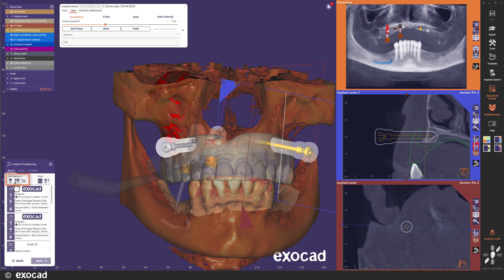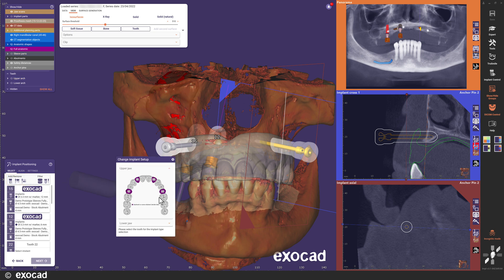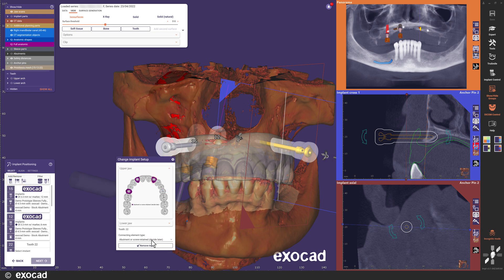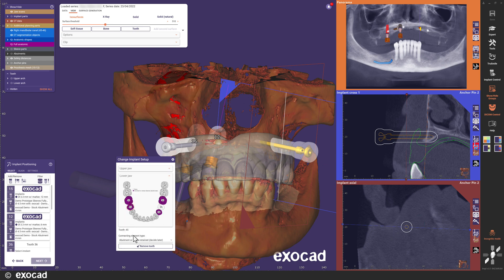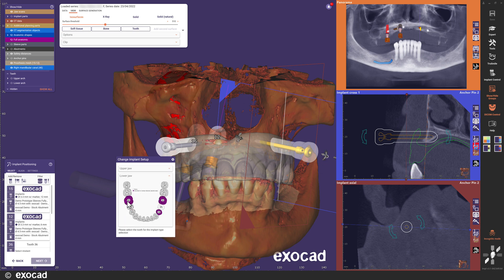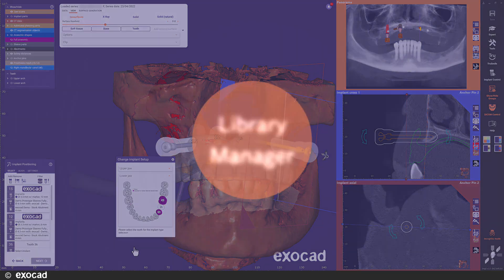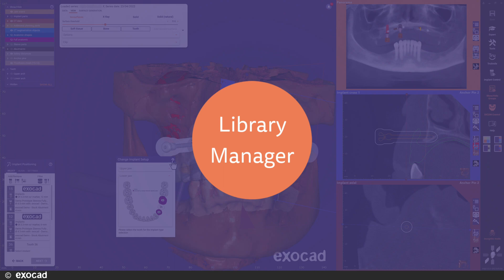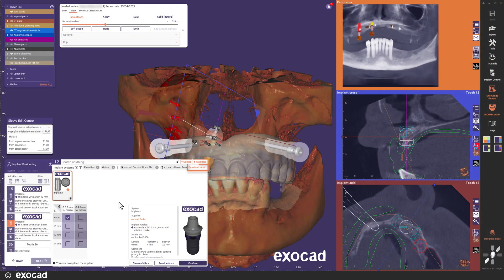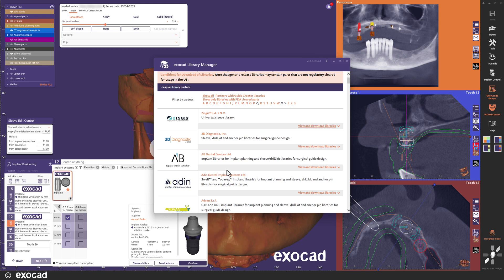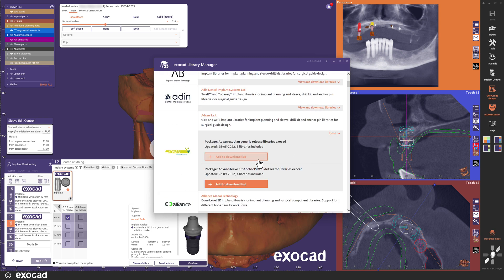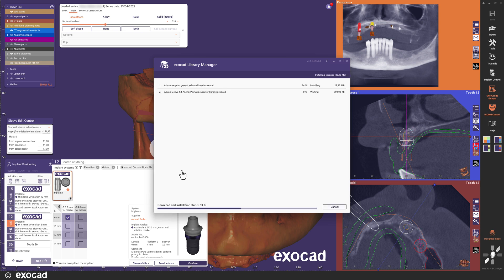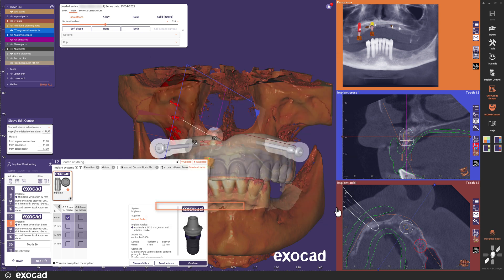We have added the add/remove implant button to the upper left side. You can alter your implant setup here. Let's remove some of the implant sites for now to make the planning faster. Another improvement in this version is that we have included the library manager. If you are missing a library, you can now easily download the one you need directly within the software. And the library manager will install it for you. You must reboot to access the newly installed library.